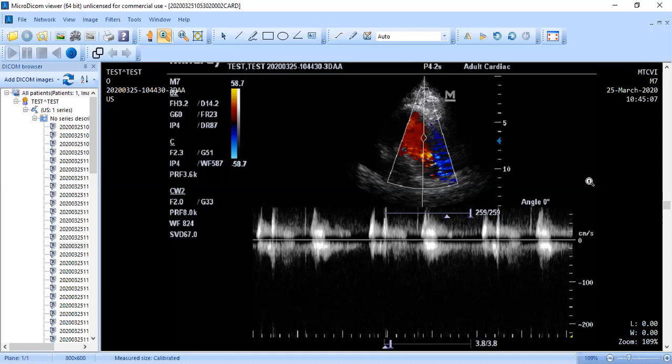Okay. A good rule of thumb to start out is to get your scale for your tricuspid regurgitation somewhere around about 2. Even if they do have mild tricuspid regurgitation, it's probably going to be somewhere around about 2. So that's just a good rule of thumb to start our scale off right there.